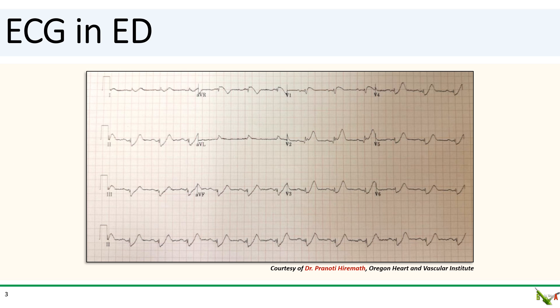Here is her ECG. V2 is a little suspicious but doesn't quite meet STEMI criteria. There are these funny-looking T-waves with upsloping ST depressions in the V leads across the precordium, and the T-waves also look a little peaked. You see the ST depressions in the inferior leads as well, but the T-waves are less peaked there. With her having ongoing chest pain and these funny ECG changes, you tell the ED that you're going to take her to the cath lab.